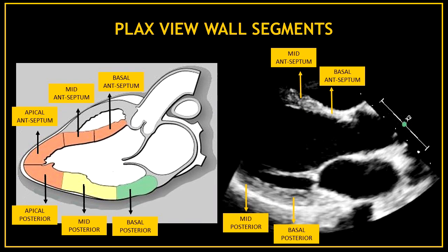We already know that we can visualize the anterior septum and the posterior wall in the parasternal long axis view. But we can also differentiate the different segments of these walls. The basal segments are the segments closer to the valves. Then we can find the middle segments, and sometimes we are able to see the apical segments from this view.